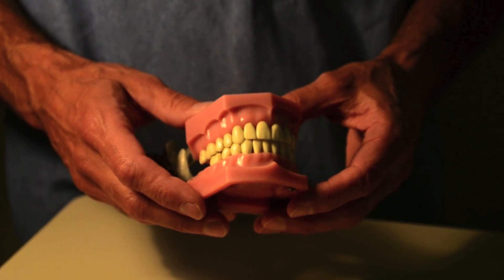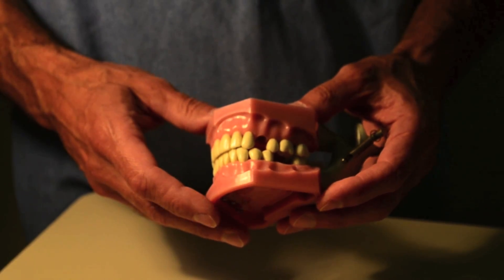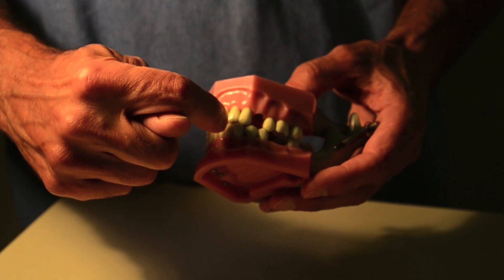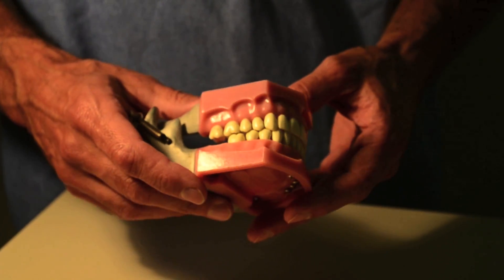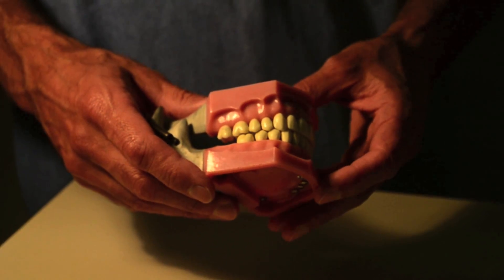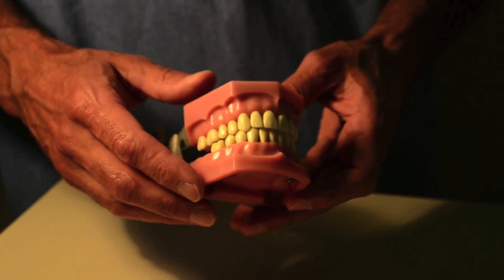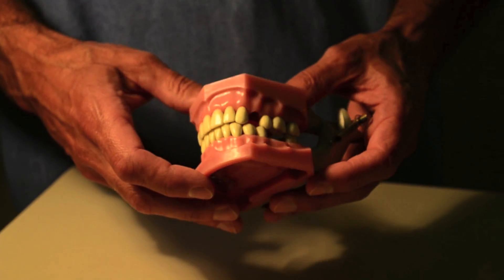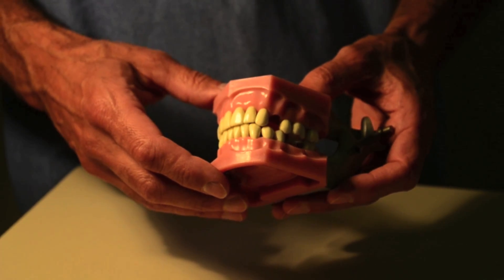When you start having situations where patients might have bilateral fractures, and especially fractures that run through the dental arch itself, that's when you should start considering using arch bars as opposed to ivy loops. Also, if you're depending upon some other sort of fixation beyond just the dental occlusion, the arch bar can sometimes serve as an additional stabilizing factor.